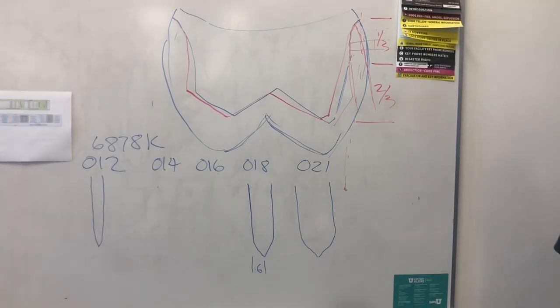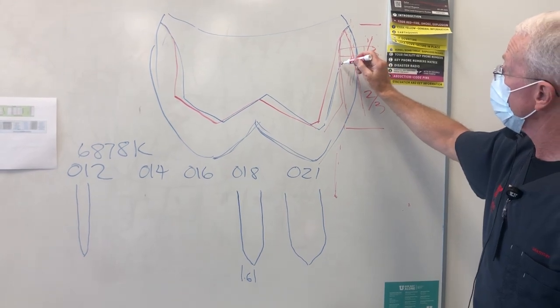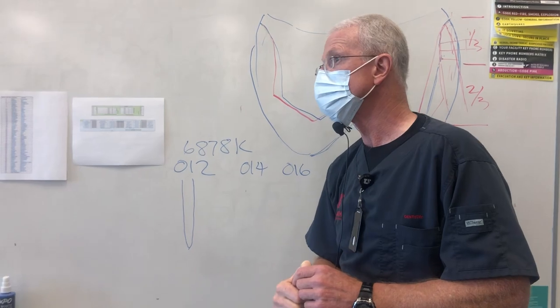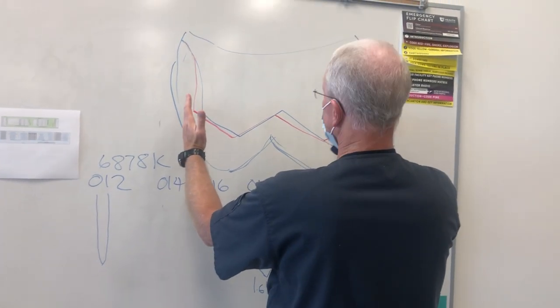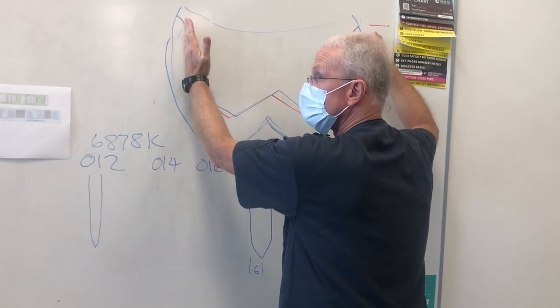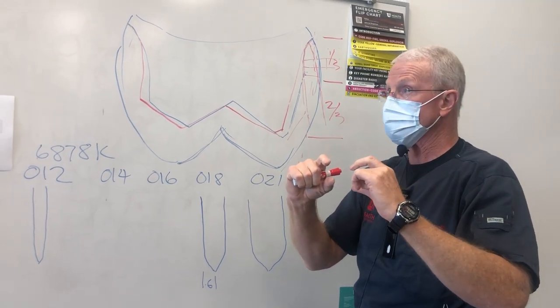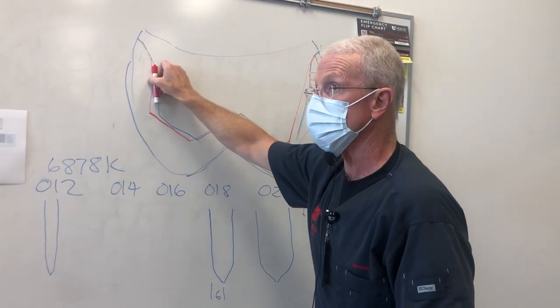Does that help? That junction where the plane changes is going to be very close to the junction between the gingival third and the middle third. Yes? Exactly, and that's a good point, we're not measuring taper between this wall and this wall. We're measuring your taper up here. Does this have an effect on resistance and retention? Absolutely. But for that category on your preparation of taper, axial wall taper, we're going to be looking at this wall with this wall.